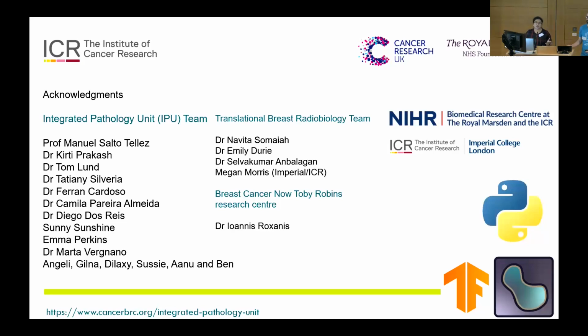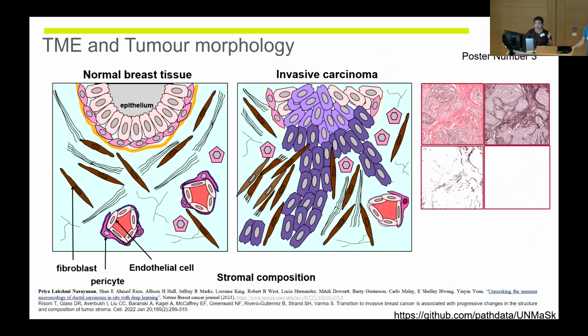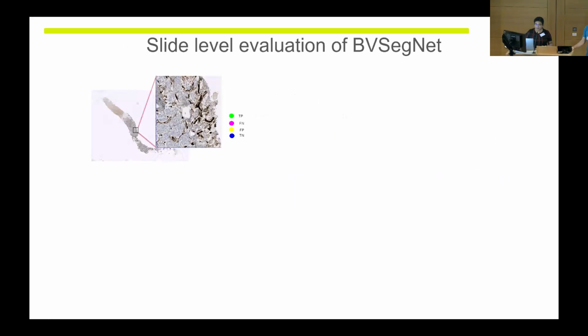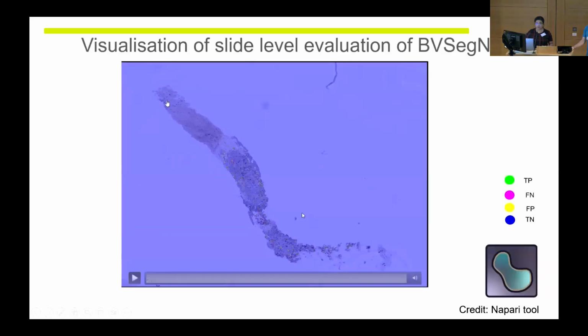We had two or three iterations from the pathologist, and that's how we learned that there is some necrosis which is not part of the annotation, so it is an iterative process that we did. So we have already seen such problems and counteracted for that. The segmentation overlay map that I showed as a video already has necrosis tissue. Yes, the part of the tissue on the upper side of the slide is the necrosis, and the one in the bottom is the active tissue. So we are not taking into account the parts that are necrosis.